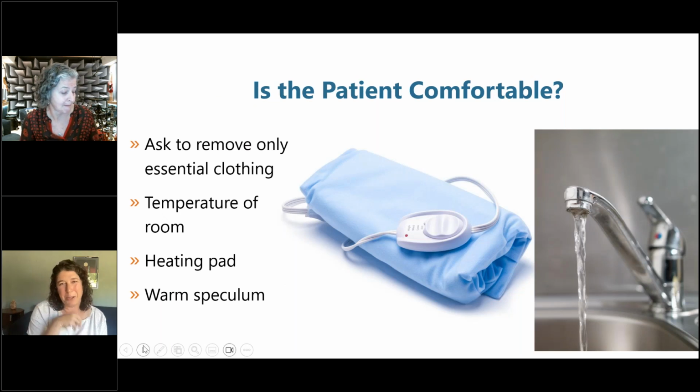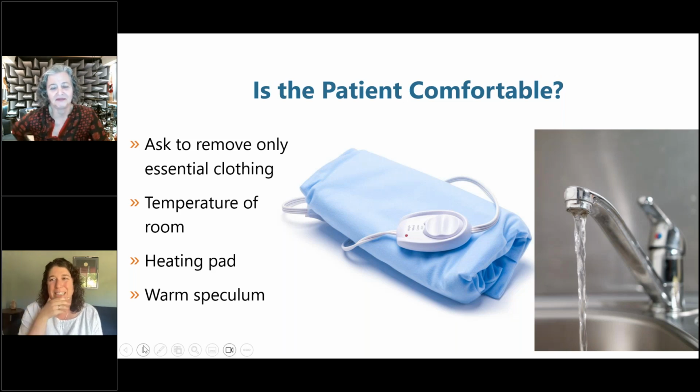And I love, Patty, that you mentioned us having adequate light, which is usually our own exam light. But then someone put in the chat also about having softer light in the room if possible. What a great idea. Yeah, and calming music if that's something either that they can listen to or you have access to that.